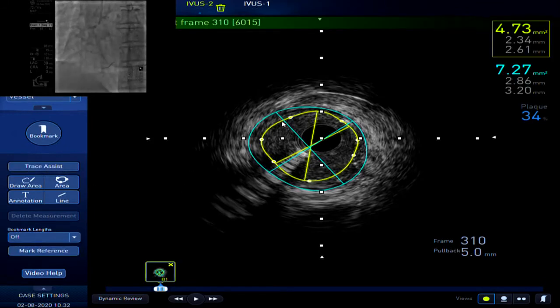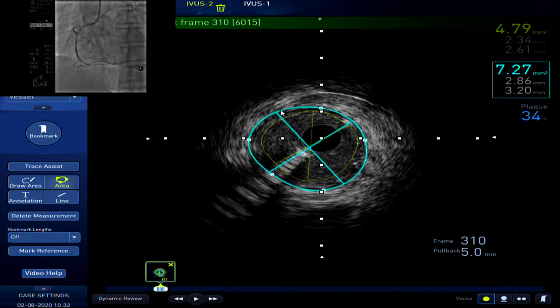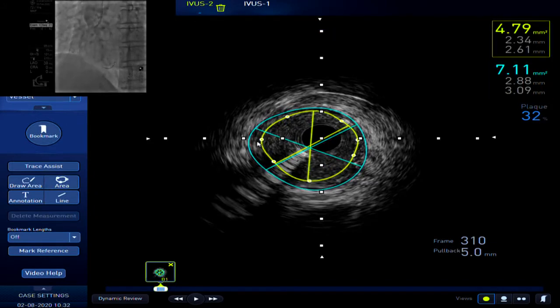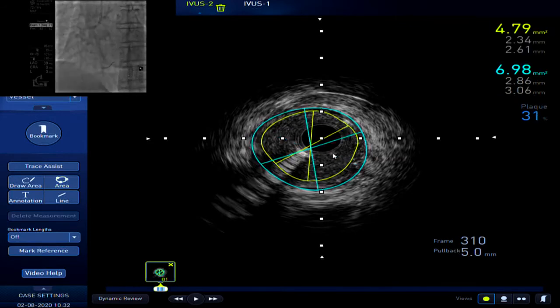The length is at least 38. We don't have a quarter size. 3.5? 3.5, 38.